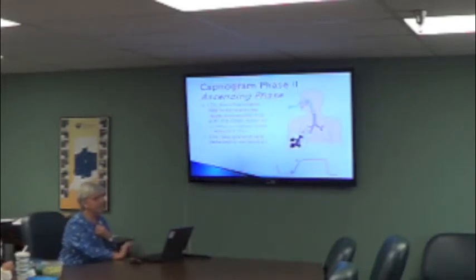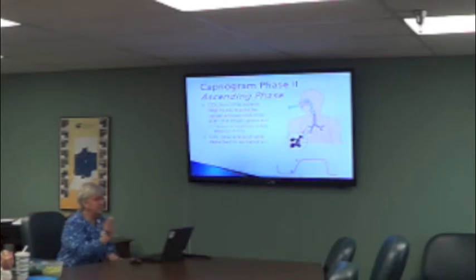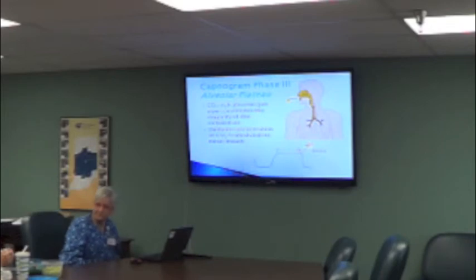The second part is, as you can see in the picture, some of the air is mixing with the CO2, and the breath continues, and the numbers go up real quick, and you can see that air has been involved in gas exchange. So what we measure when we measure end-tidal CO2 is at the end of the breath, the end-tidal, an alveolar plateau. The gas exchange has taken place at the end of that breath. Does that make sense?